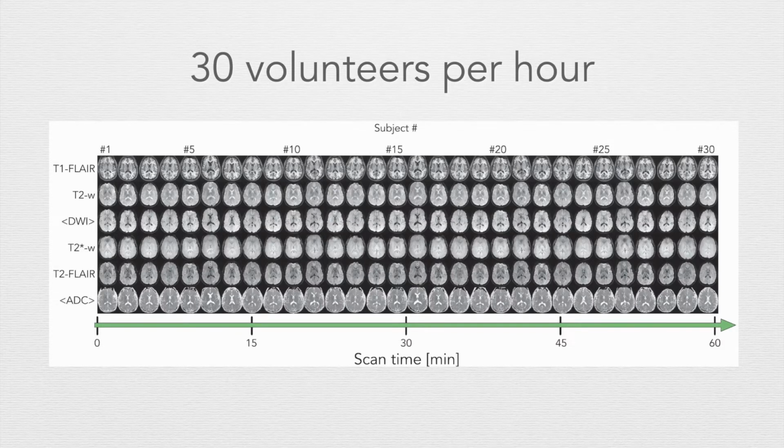And if you look at the CT scan, where the brain can be acquired in a second, you still cannot push through more than about 6 patients per hour in a real hospital, because of the necessity to have some decency with the patients. So we have reached this limit where we are no longer limited so much by the scan time, we're more limited by the rest.